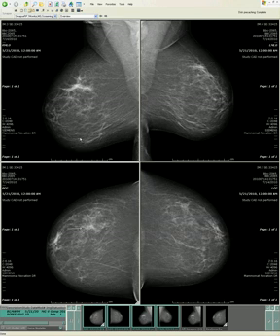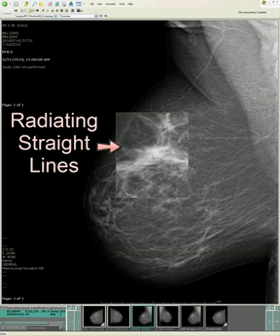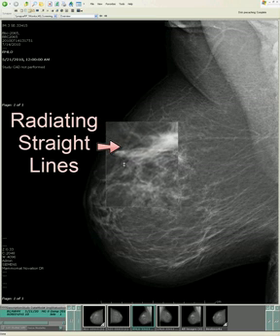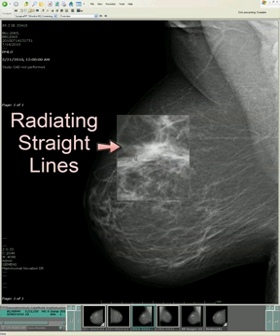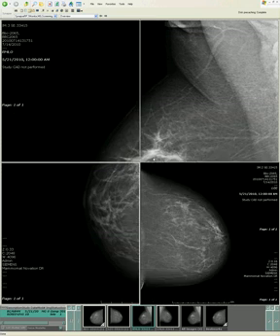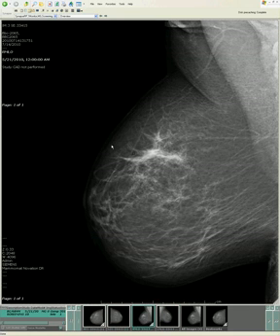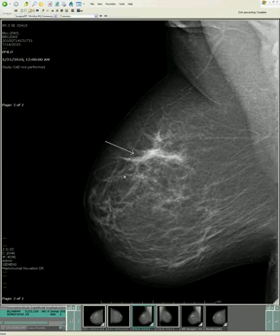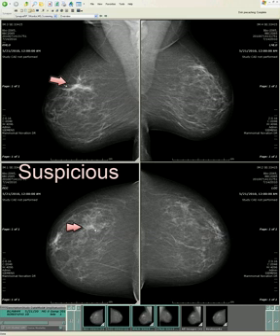They don't seem to be going all the way through the area. If they were really ligaments, they would continue on through. And here's the other view. When we look at this on magnification, we again see there is this persistent radiating straight line kind of appearance. This whole area just looks bizarre. It doesn't look like anything else on either view. So this is very worrisome. There is this distortion of the tissue.